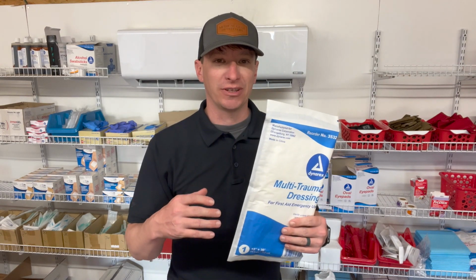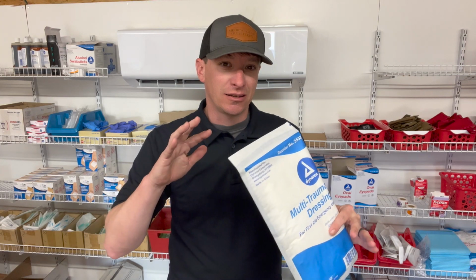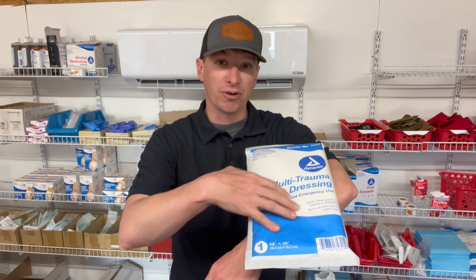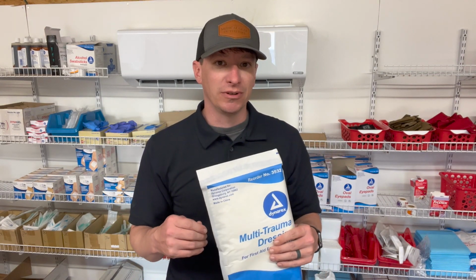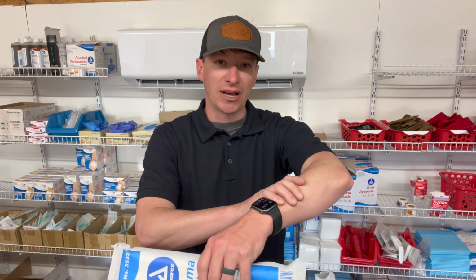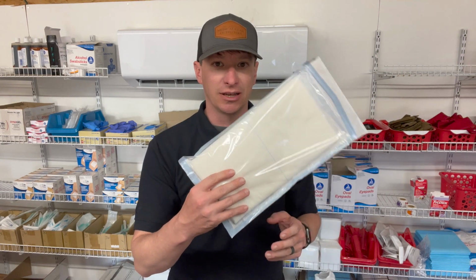This is gonna be for that avulsion, skin tears, nasty cuts, but you don't need a tourniquet, just maybe you need a bulky dressing, things like that. That's kind of what I would use this for. So obviously if it's a major laceration, we do something different, but multiple lacerations that are just oozing blood, things like that, this is a perfect example of that.